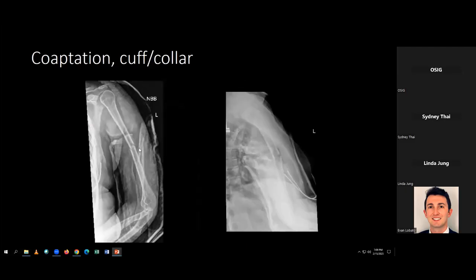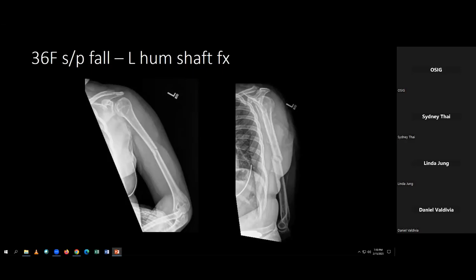Just to stop you one second. If you didn't know whether it was a man or a woman, what may give you an indication as to the gender of the patient based on that radiograph there? I assume you're not asking me. I'm not asking you, I'm posing it to any students that are looking here.